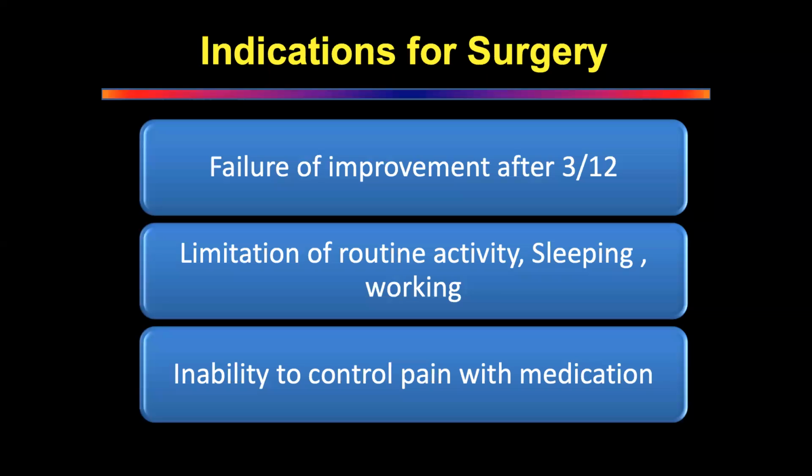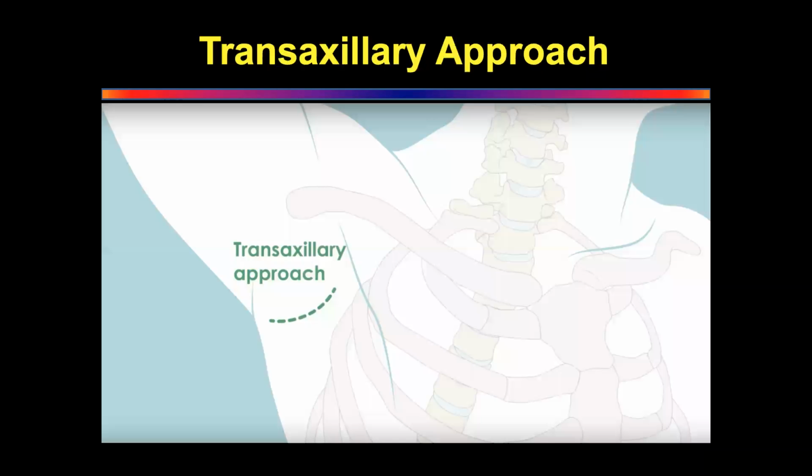After anesthesia fitness and single lumen tube, a patient in lateral position, hyperabduct the arm and then palpate the ribs, and in the upper part of the axilla, a horizontal transaxillary incision, and then splitting and retracting the muscle.